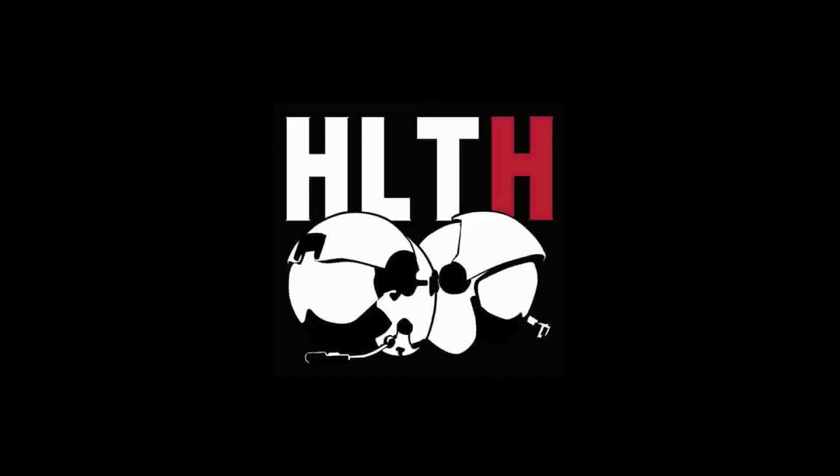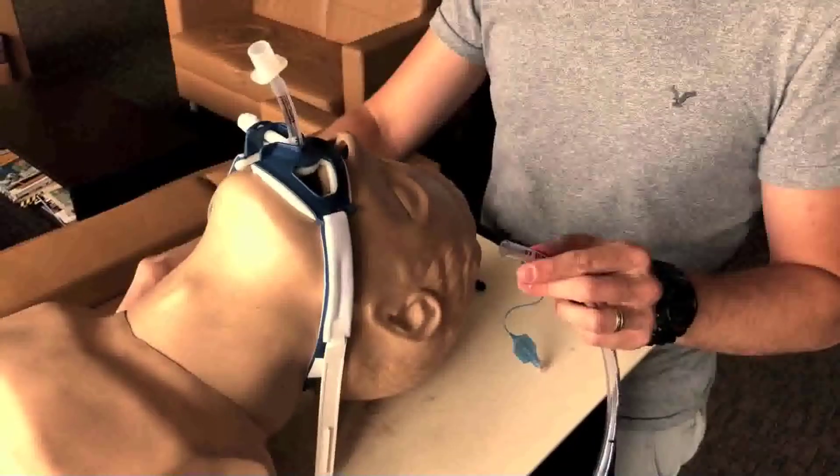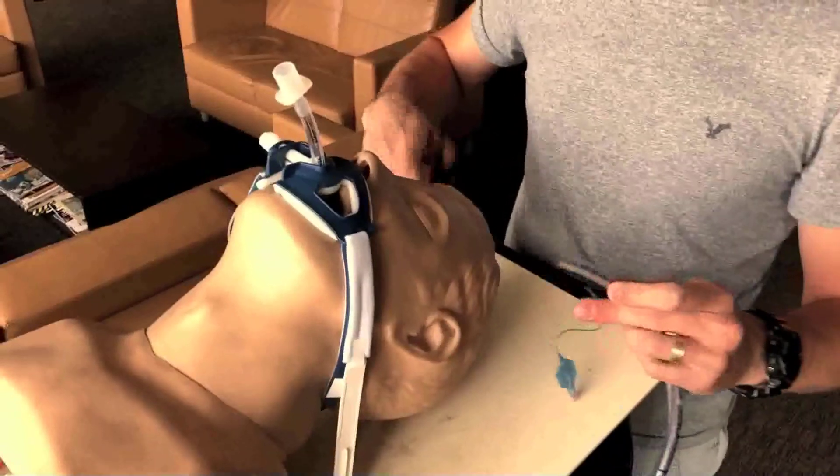This is the video that accompanies episode 21 of the Heavy Lies The Helmet podcast. Here we see that we have an 8.0 endotracheal tube.